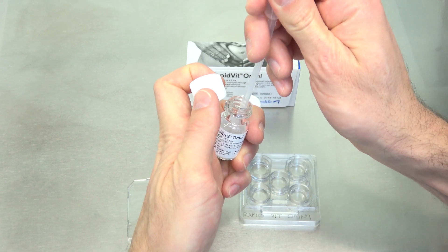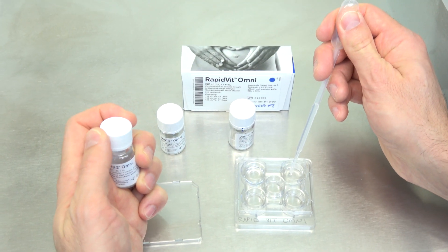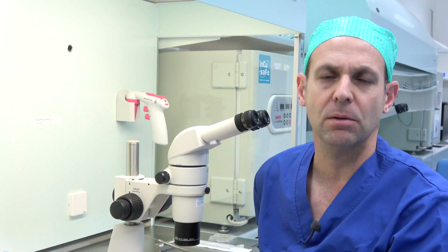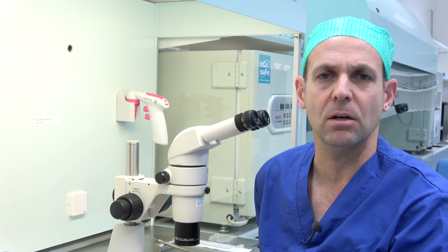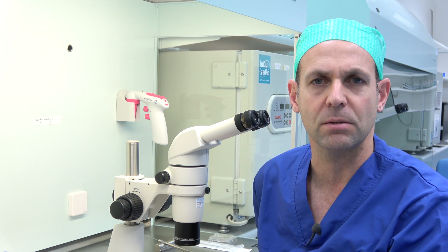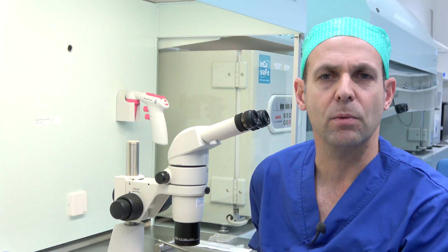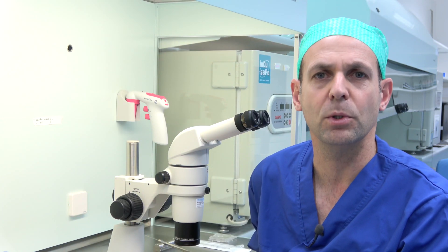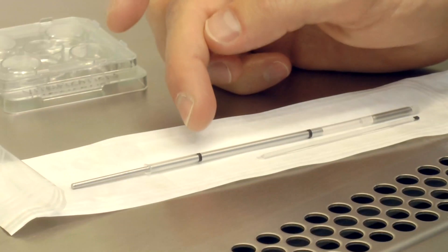Place between 0.5 and 1 ml of the vitrification solutions in separate wells of the 5-well dish. Place the lid on the dish and warm to 37 degrees Celsius. Do not place any of the Omni vitrification solutions in a CO2 incubator. When using the RapidEye, make sure you label the right number of Rapid straws before you do the vitrification. Place your labels between the two black lines on the Rapid straw.